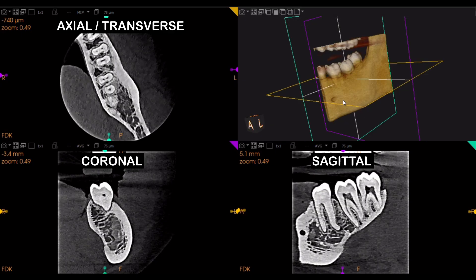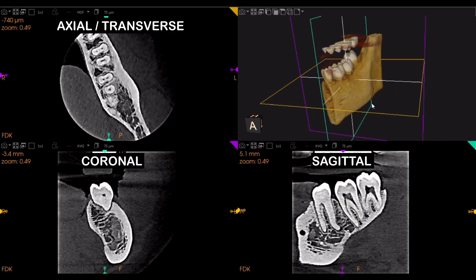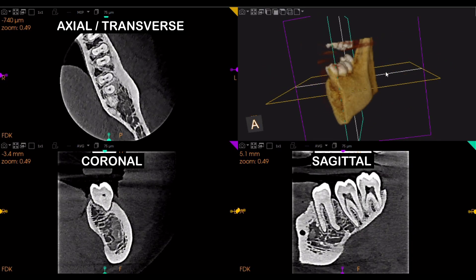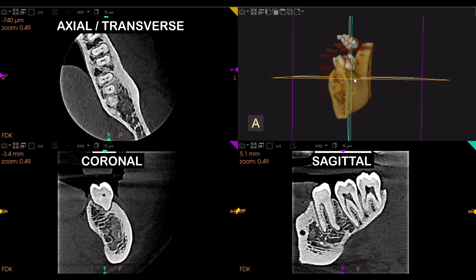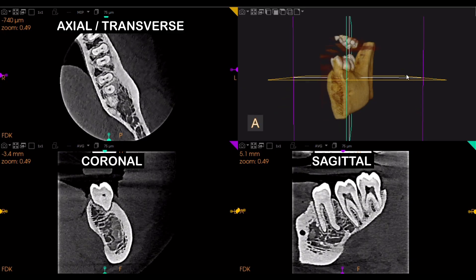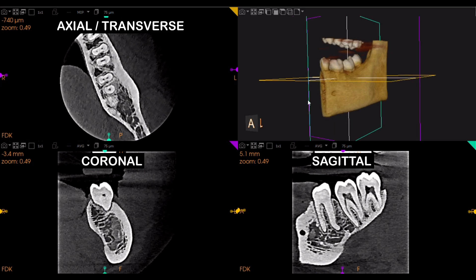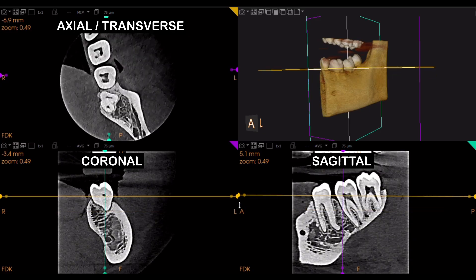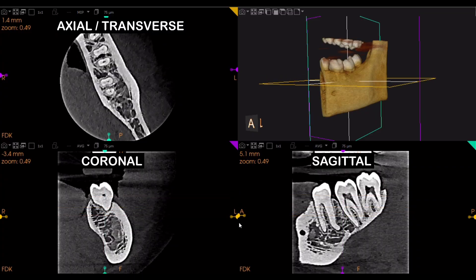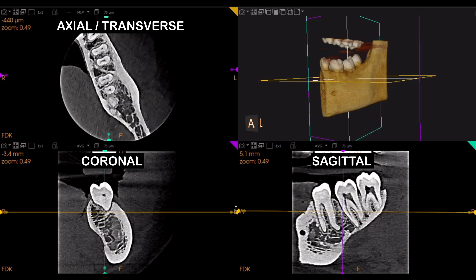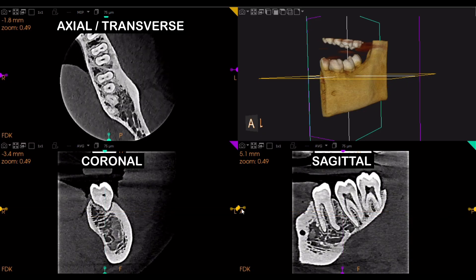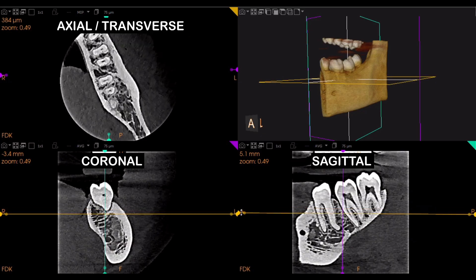In this 3D reconstruction you can see three wireframes: a yellow one, a purple one, and a greenish one. The yellow wireframe is dividing the structure into two parts — the upper and the lower, or the superior and inferior part. The section that we get through this is the axial section. As we move the yellow frame up and down, you can see the image changing, basically showing us the internal anatomy at the point where this yellow wireframe is.